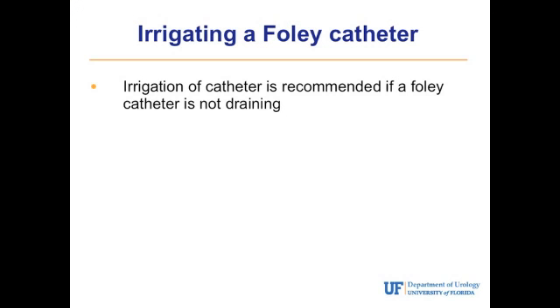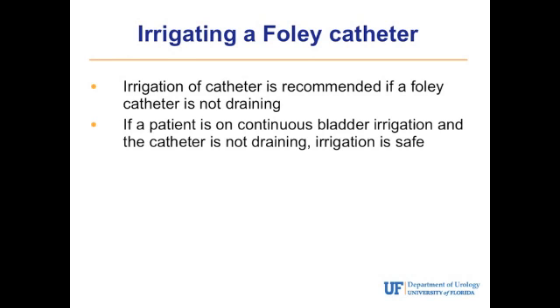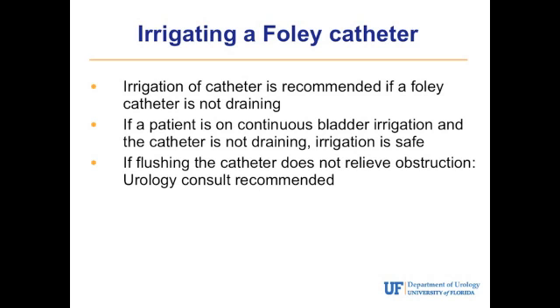Irrigation of a Foley catheter is recommended if the catheter is not draining. If a patient is on continuous bladder irrigation and the catheter is not draining, irrigation is considered safe. If flushing the catheter does not relieve obstruction, a urology consult is then recommended.